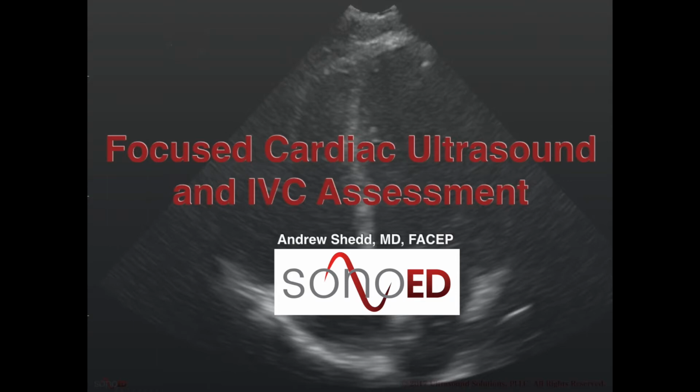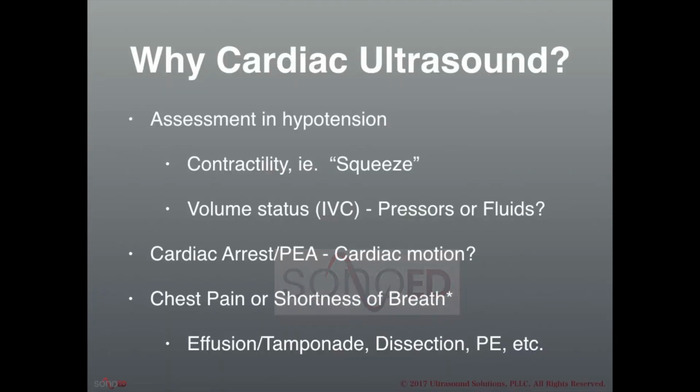And so I really think that in addition to probably the FAST ultrasound, the eFAST, this is probably the most useful ultrasound that you could integrate into your practice. I would encourage you to pay particular attention to this one. Make sure that you garner all of the concepts and take your time going through this. Hit the pause button if you need to review something or look something up or study something more in depth, because this one can certainly be practice changing. So without any further ado, let's begin.